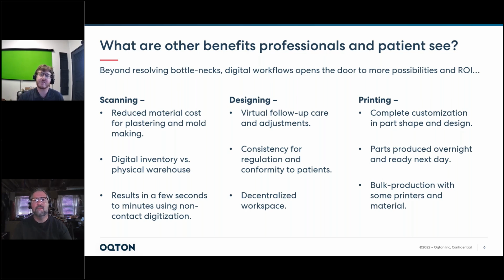We're going into the designing realm, virtual follow-up care. We've already emphasized that a little bit. Another big area is the consistency and regulatory needs to conform to patients. So by using CAD software, if something needs to be 3 inches in size, you can make it 3 inches in size consistently every single time, which really helps out with creating conformities and making sure you're meeting all of your regulatory needs.